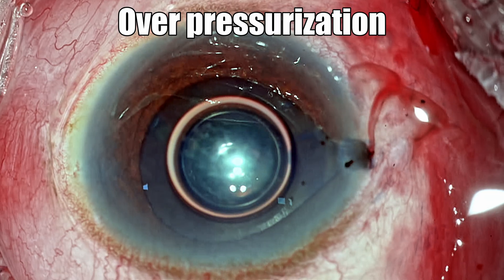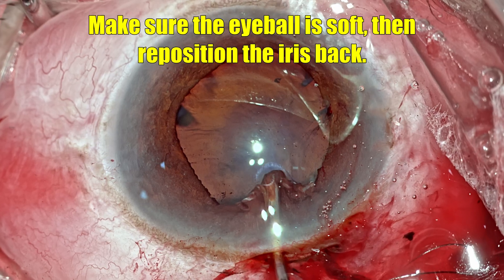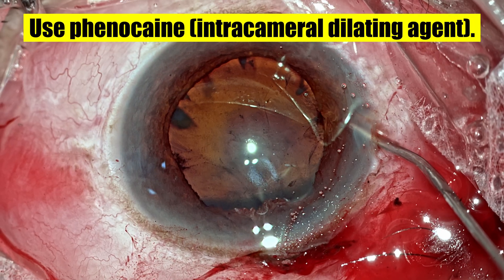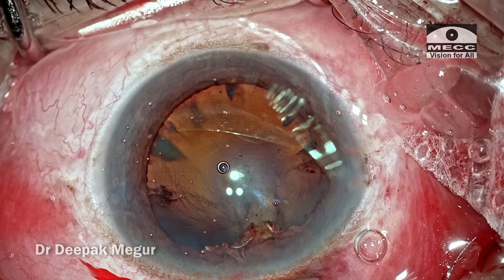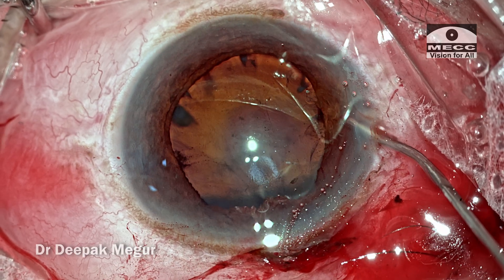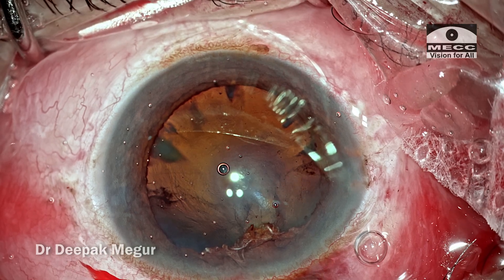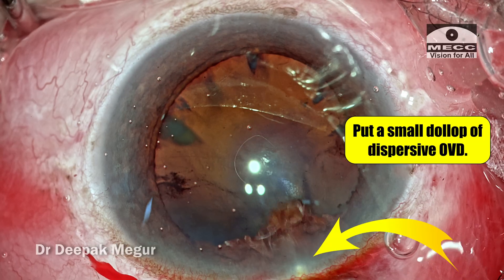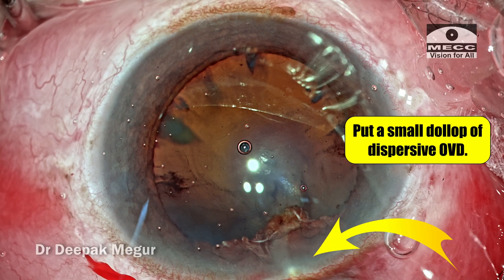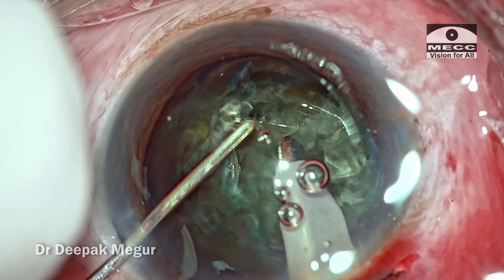Lesson number one: address the cause. The cause in this case was overpressurization. When you want to reposition the iris back, make the eyeball soft and then try to push it. Number two: use an intracameral dilating agent like phenylephrine or adrenaline, which is going to improve the tone of the iris and help in further prevention of iris prolapse. Number three: put in a small dollop of a dispersive OVD just on the surface of the iris — a few seconds later, the iris would start to behave well, and we can continue with the surgery.